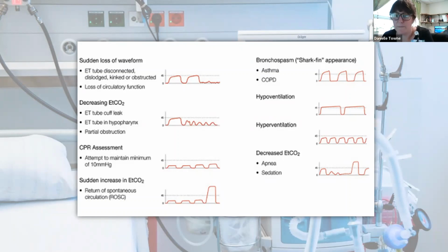Let's think about it this way. Let's say we have a tachypneic patient that has metabolic acidosis. Let's say it's like a DKA patient, right? And their pH is like 6.9, 7, it's terrible. You end up intubating them for whatever reason, because intubating a DKA person is not always the best idea unless you absolutely have to, because they're very difficult to manage on the ventilator. It's a totally different topic to talk about. But let's say you decided to intubate them and their opening end tidal is 18. Okay. They were chugging along, breathing 40, 50 times a minute, and their end tidal is 18. All right.